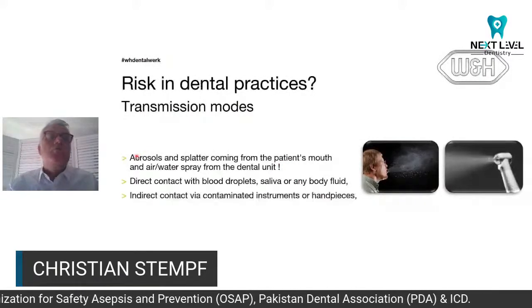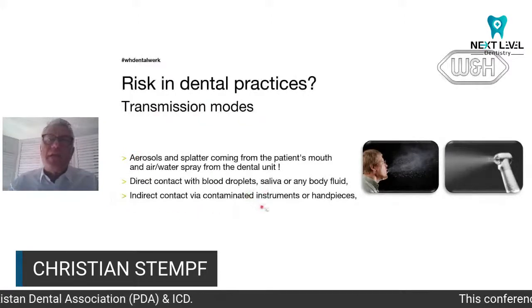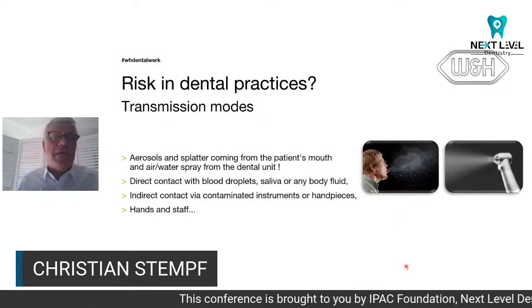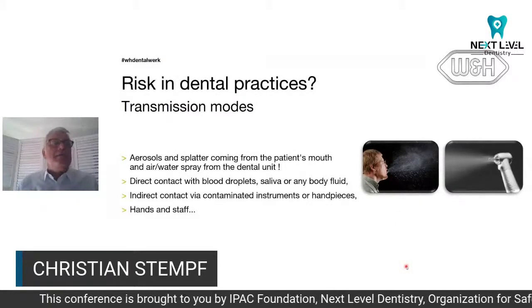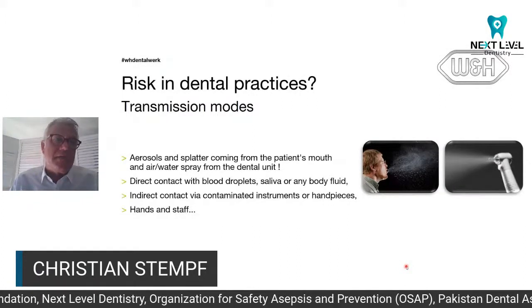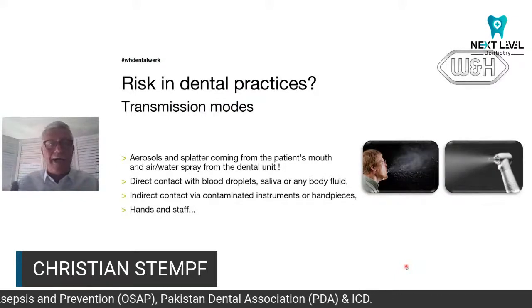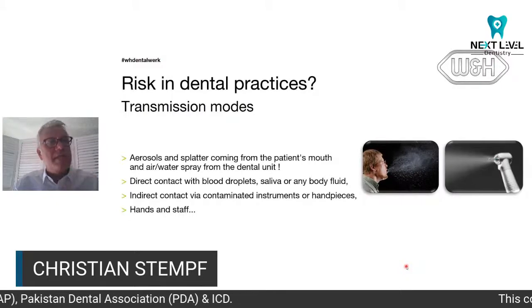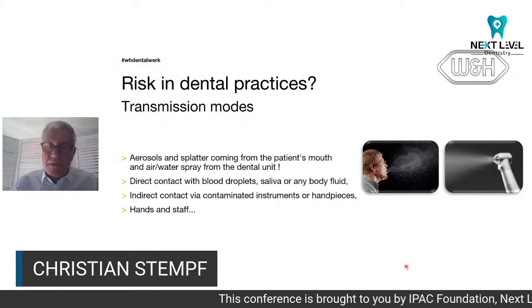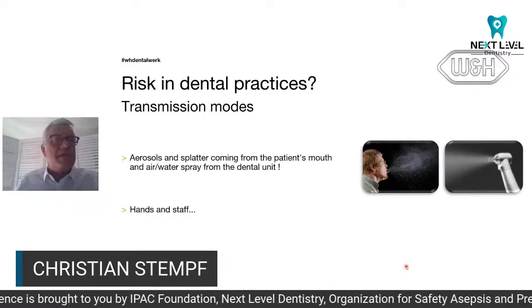You could infect your patients with improperly processed, non-sterilized instruments, especially the handpiece that enters the mouth. Hands as well. Most infections are transmitted by hands. We keep touching our face, and our hands are highly contaminated, and we put these hands on our mouth, on our lips, and sooner or later we might catch something. So I'm going to focus on these two, of course, reprocessing.